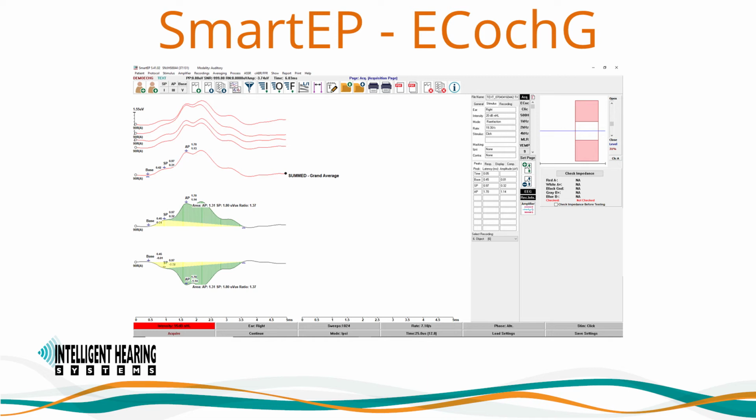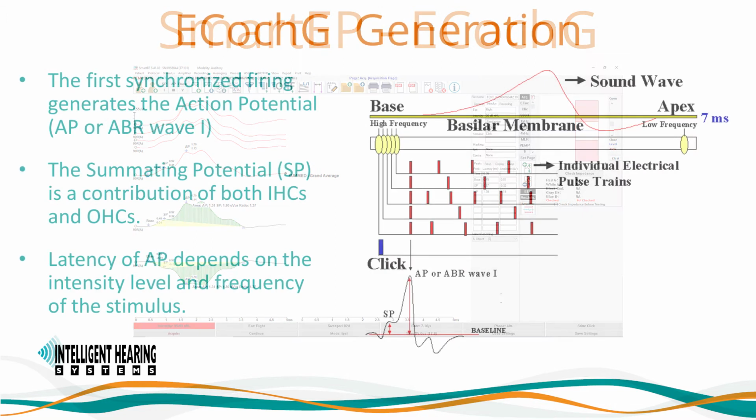Hello, welcome to this training session for SmartEP Electrocochleography by Intelligent Hearing Systems. Today, I will walk you through the patient and software setup for performing and analyzing an eCoG test.